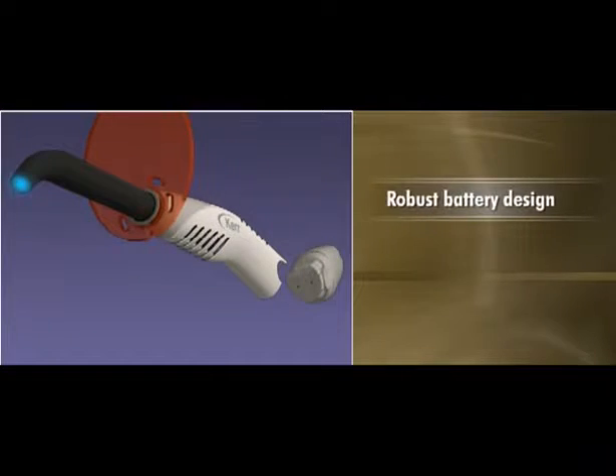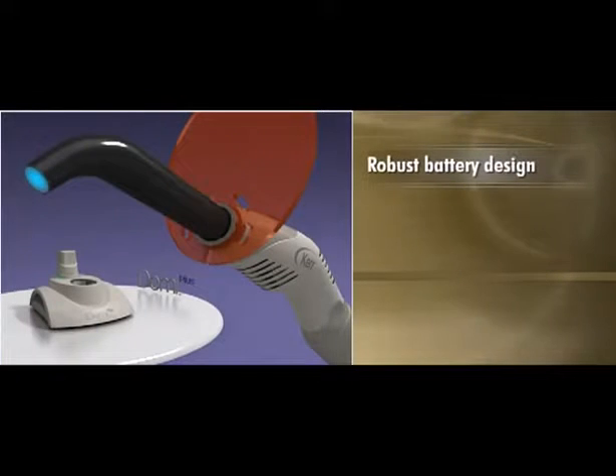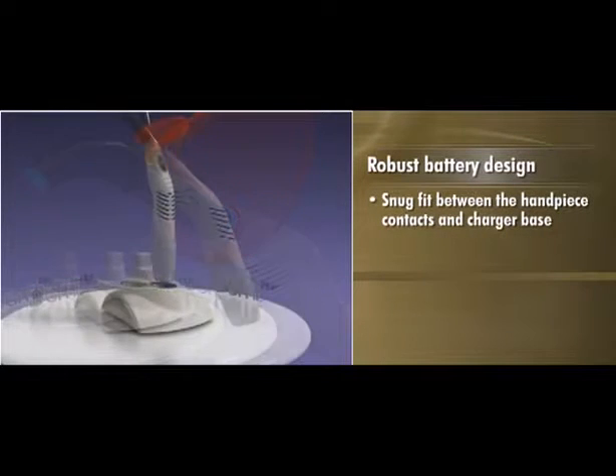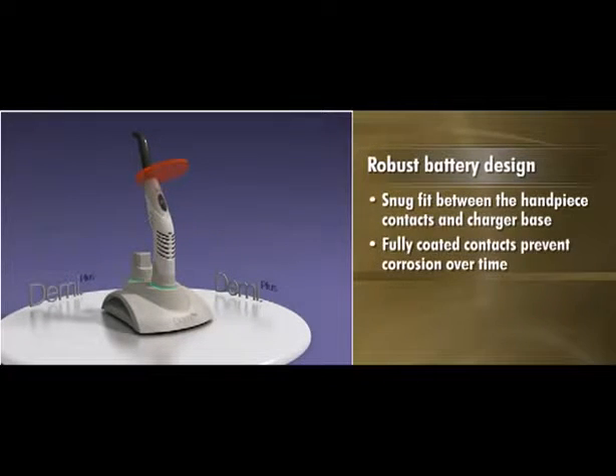The new robust battery design simplifies charging to ensure 300 10-second cures with a single charge. The positive contact charger guarantees a snug fit between the contacts on the handpiece and the charger base, and fully coated contacts prevent corrosion over time, allowing you to get the most out of every charge.